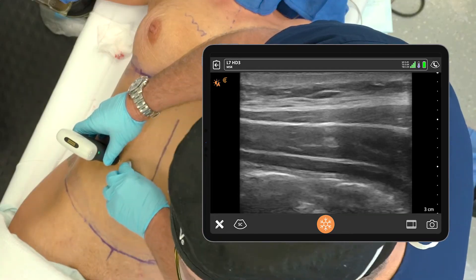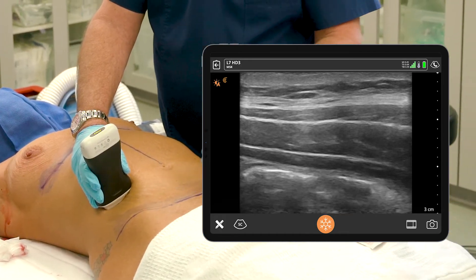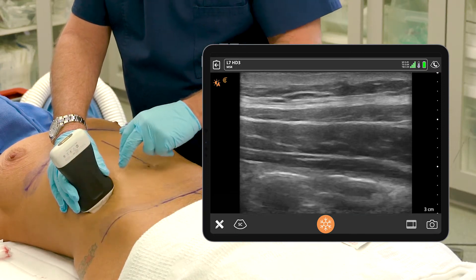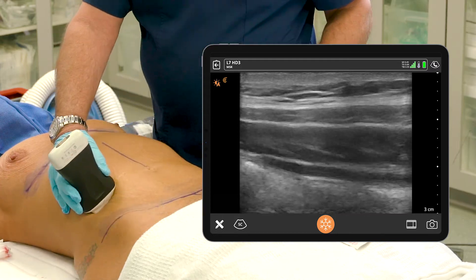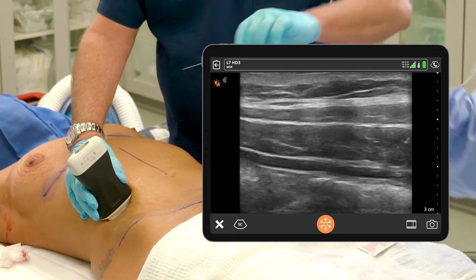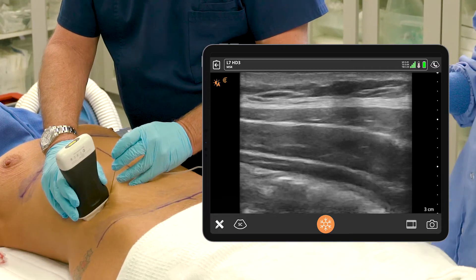Now we're going to do the TAP block on the opposite side. This is in Petit's triangle, between the costal margin and the anterior superior iliac spine — usually just in front of the anterior axillary line, or wherever the muscles look most separated. Just above the umbilicus is usually where this goes in. I'm going in perpendicular to the skin.